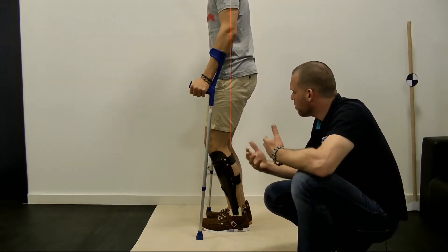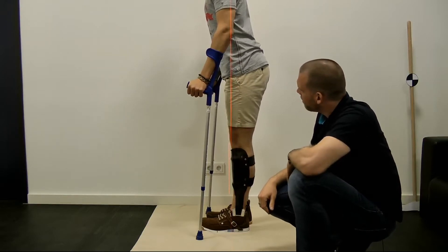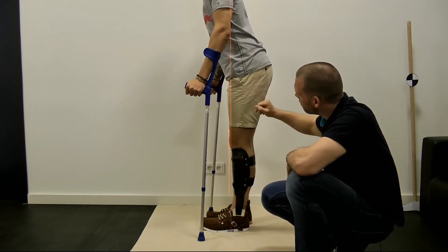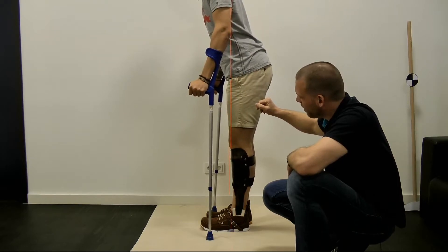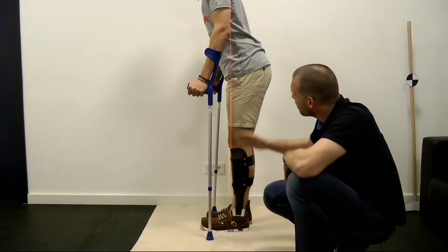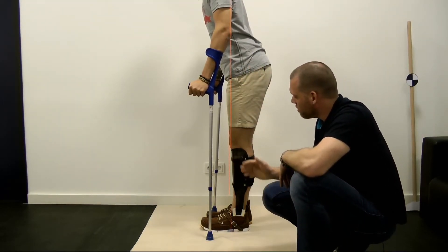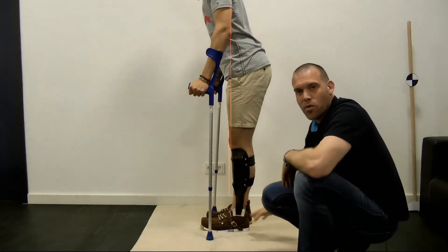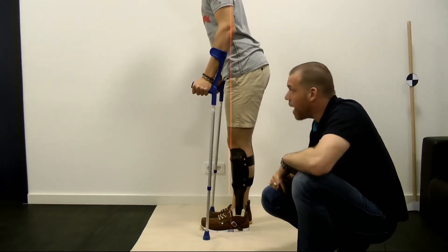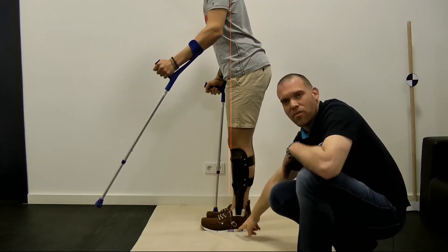Another position we observe is when patients have hip flexion contractures. In this case, the tibia is not in a physiological inclination — the upper body is forced to move forward while the buttocks stretch backwards to achieve some stability over the supporting area. The question again is whether Henrik can stand at this moment. Yes, absolutely, because the plumb line from the body center of gravity falls over the marked area on the foot, and therefore he can achieve stability in standing.